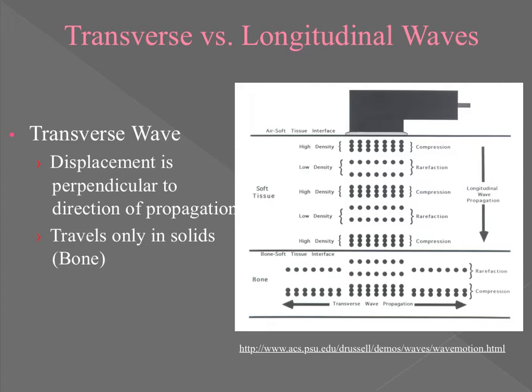There are going to be times where we have to ultrasound an area of the body that is extremely bony. And I can think of 3 prominent areas in the body right now just sitting here lecturing. The first one is for medial tibial stress syndrome, as we ultrasound that tibialis posterior and we get really close to the tibia, right?